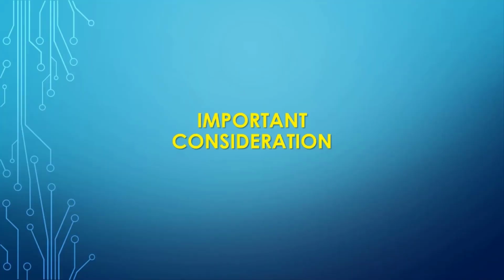In some patients, every time you decrease the PEEP, compliance increases. In such case, the minimum PEEP allowed will be 2.